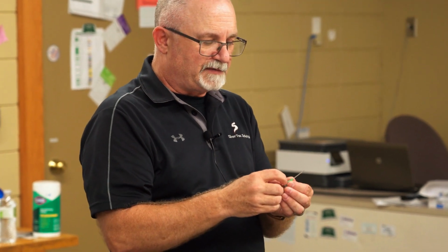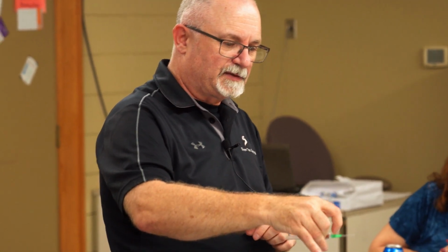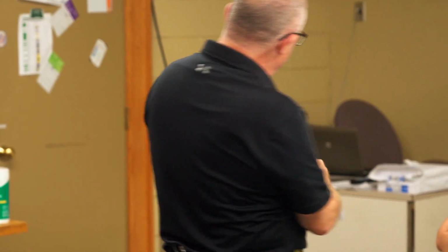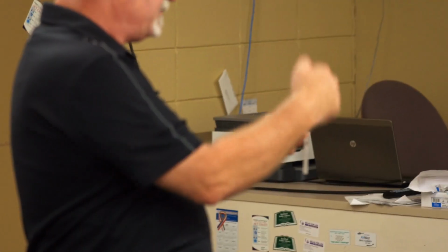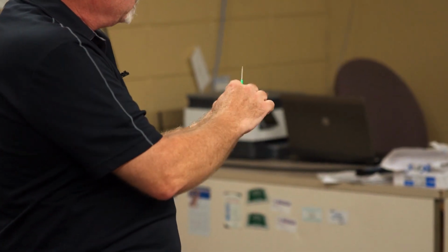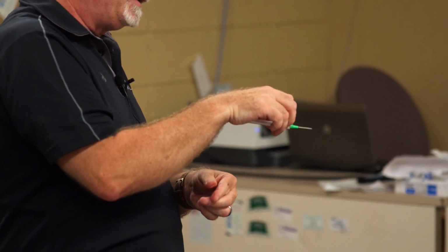So just enough to twist it a little bit, if there's any residual plastic to plastic melted together, kind of stickiness is gone. And then I generally hold it like this and then use this, keeping some back pressure, and then we'll go in. I'll show you on the arm here in just a second. But in here is your flash chamber. If you look in that middle piece, as the bevel goes into the vein, blood goes down the needle, fills up into the flash chamber, and you go, okay, I'm there, I see that. Then I know I'm in the vein, and then we just move that across.